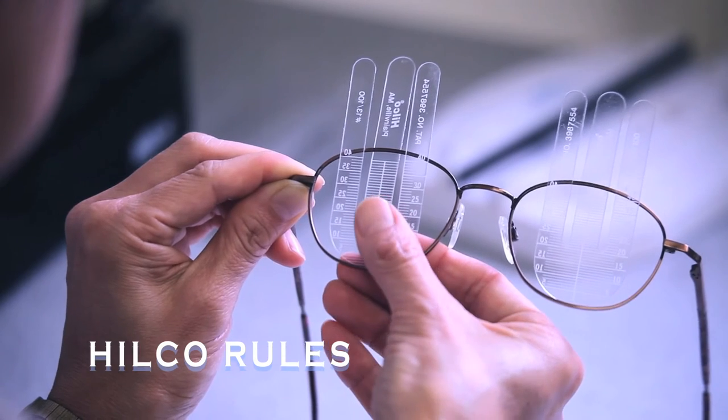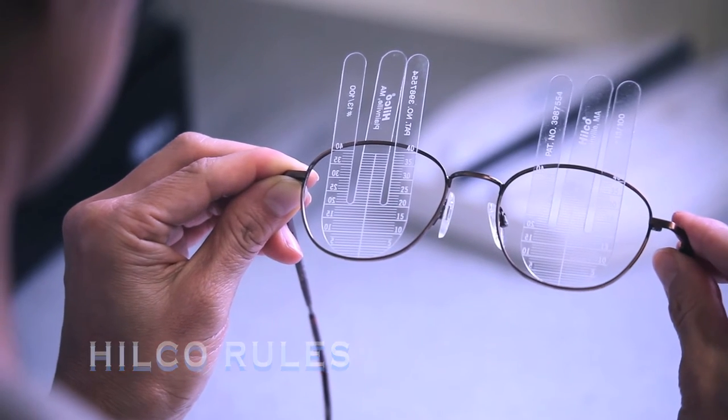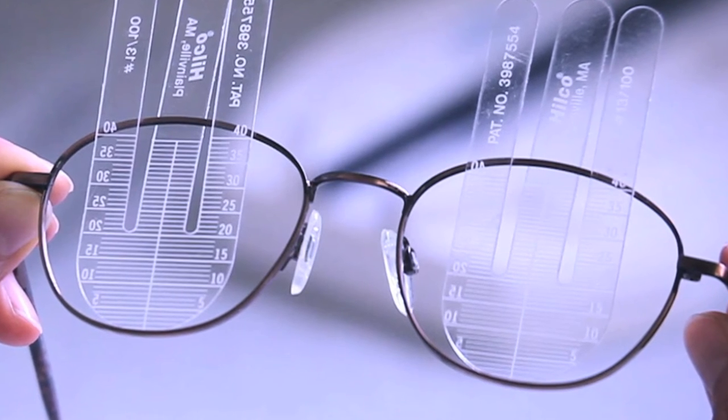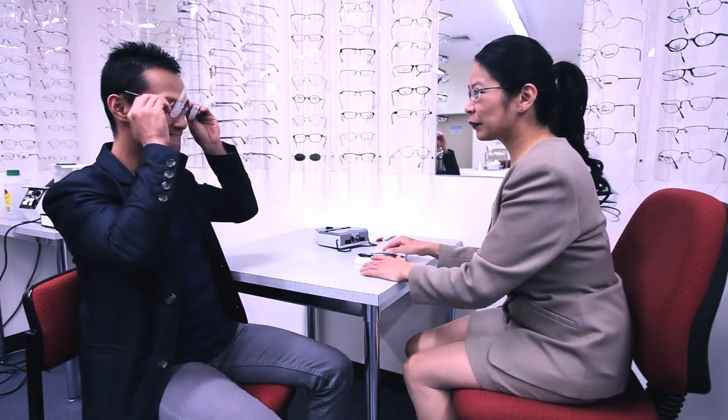The second alternative is two small seg height rules, which are positioned in the bottom rim of the frame and clip around the top rim. Note that seg height rules can only be used for full rimmed frames. With your client's head at the same level, note the point that is level with the center of the pupil.